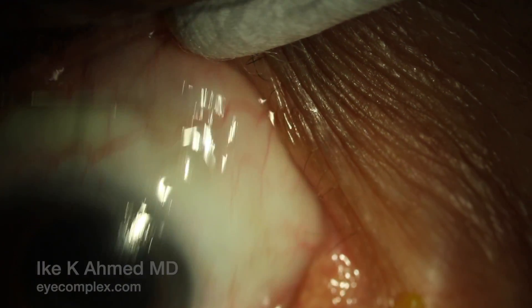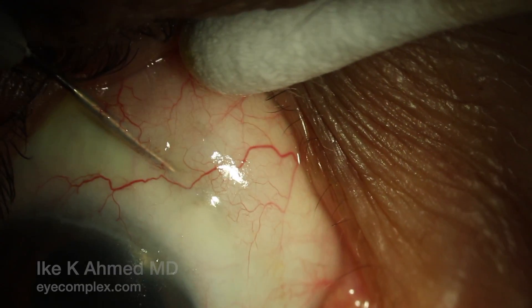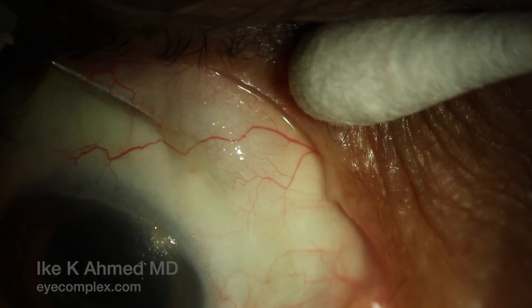It's these underpass and overpass techniques — sliding the needle above and under the implant while sweeping toward the fornix — that allow for freedom of the implant. The implant is now more free and it moves as well.